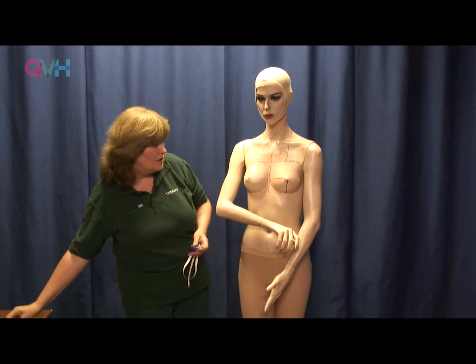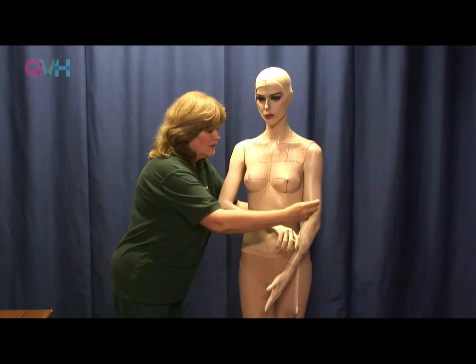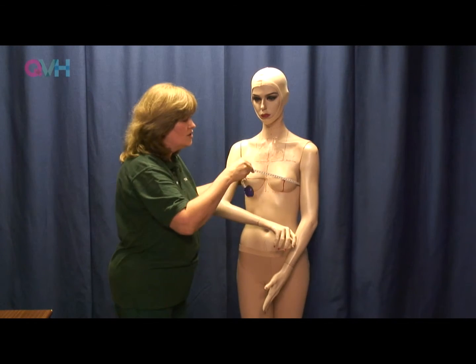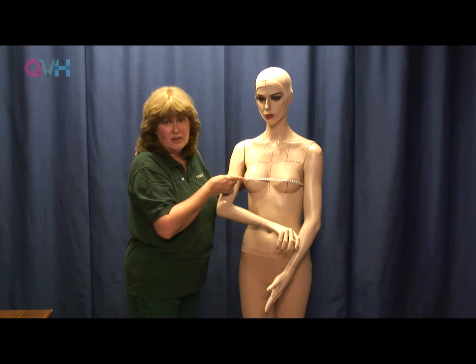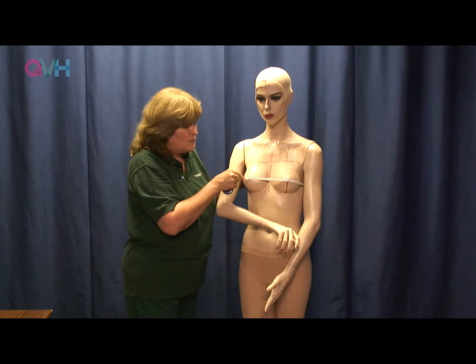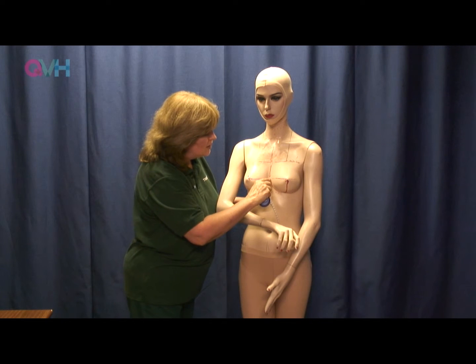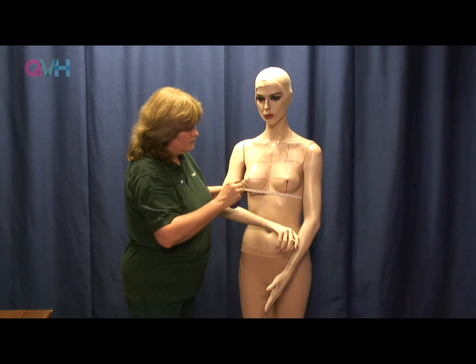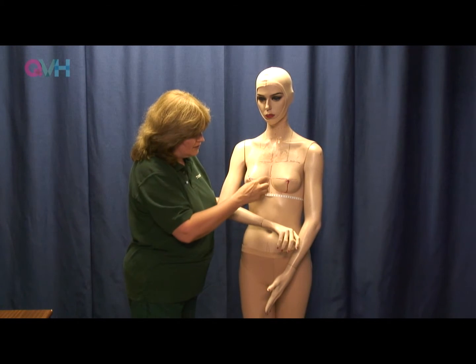Then you can move on to the next line, and whether it's a child or a man, you can usually go straight across the nipples, but on a female it is harder. So you just make that mark on the man or the child as to just where you've gone across. On a woman you would make the mark that is just where the breast drops away, and then you'd record the measurement, and again you'd leave the mark.